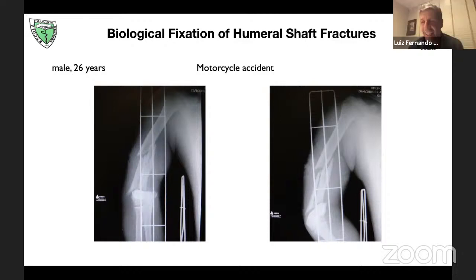Yes. So I'll plate this with the anterior bridge plate. I think the AP, whatever you are seeing in the picture, is an end-down view of the flexed fragment. But in the lateral, we can see that there is some place to put at least 1 or 2 screws. So definitely, it will be a case for Sergio to handle with the anterior bridge plate.